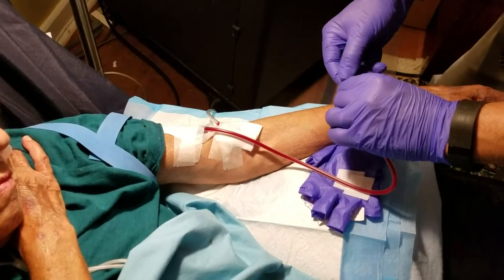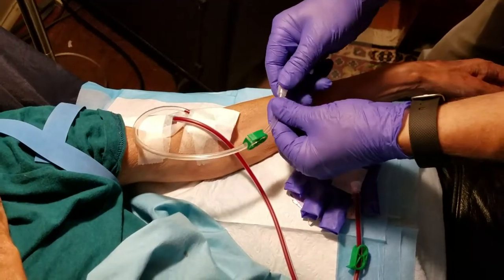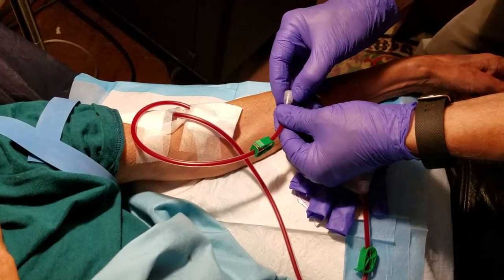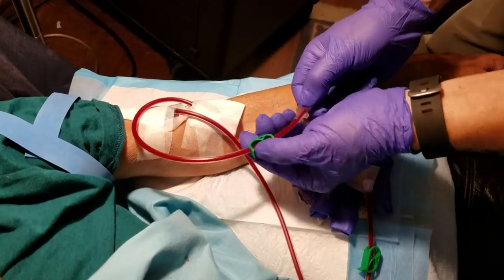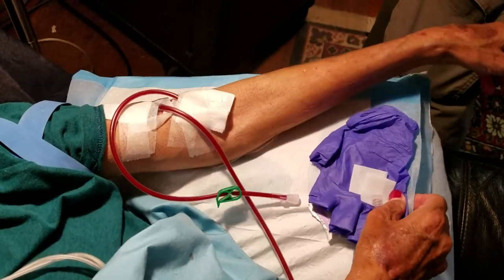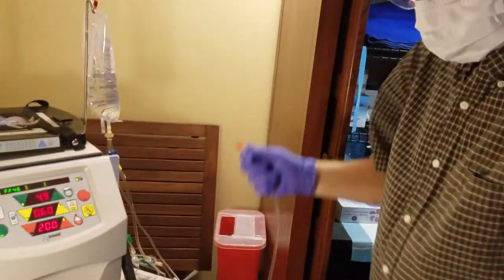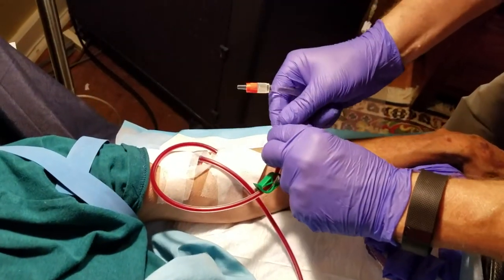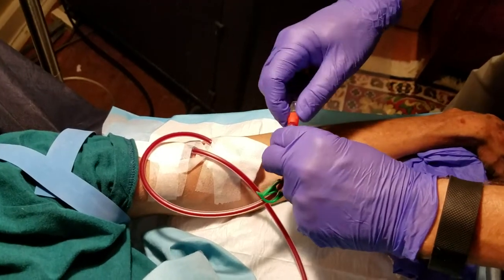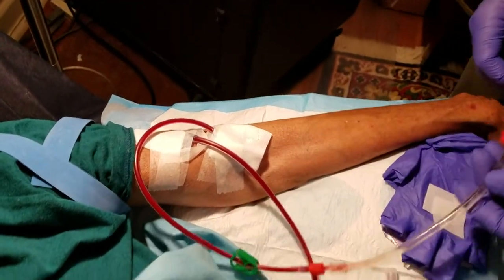And I bleed the lines. Now I clamp this — make sure both ends are clamped. Lay it on there, twist it a little bit, make sure it's airtight. You don't want any air leaks, because that's where the blood is sucking from.